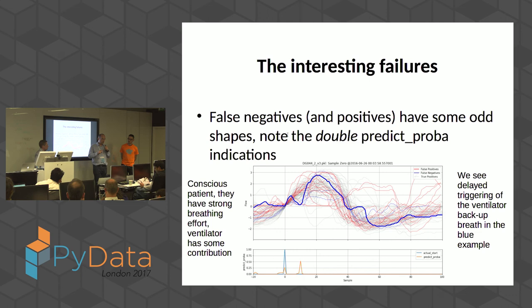And that's because they will be able to rely on more data and more indicators and more frequent data than what clinicians do. Clinicians use an experience-based, very simple, knowledge-based algorithm for when I think the baby is getting ready, and therefore there is about 10 to 20% extubation failure. I think the answer is yes, but I don't know how to achieve that.